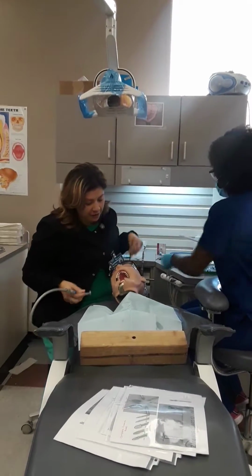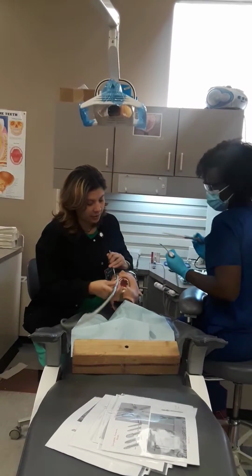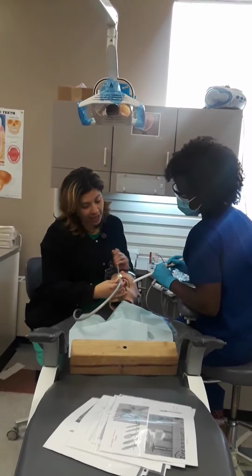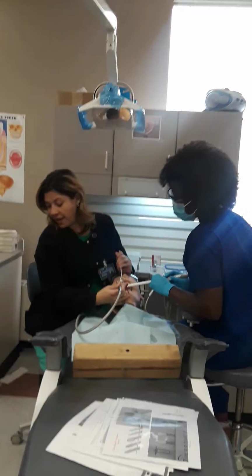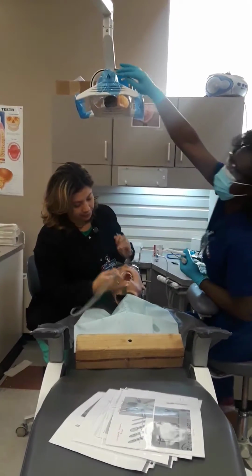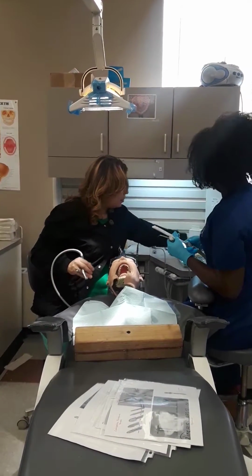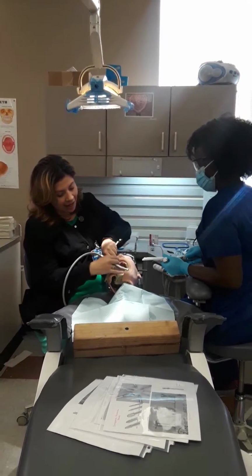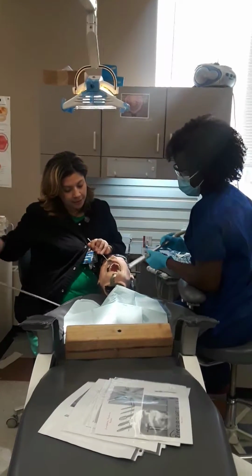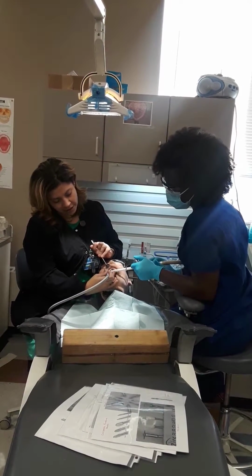Okay, so we'll do different services. We could do a class 5, we could do an occlusal, we can do a DO. We'll kind of speed this up. We're going to do the same, tooth number 6, facial 5. Pass the cotton roll to retract. The cotton roll will help keep the lip up and out of the way. And then I'm going to do a facial class 5, tooth number 6.